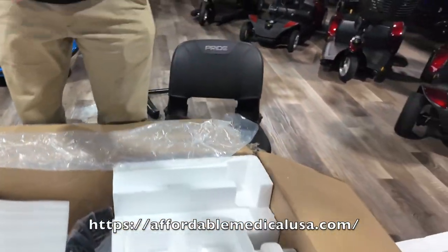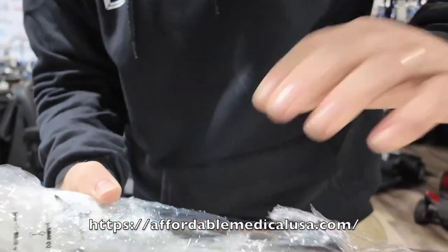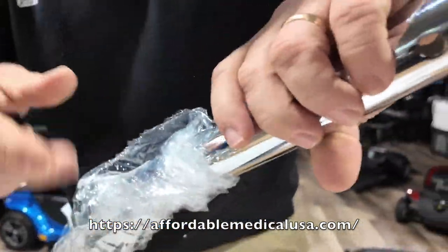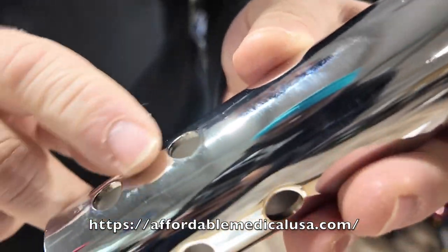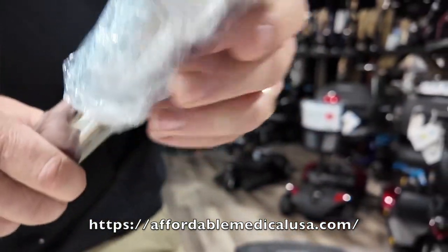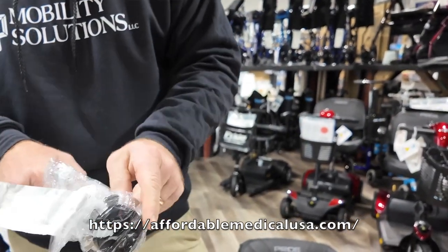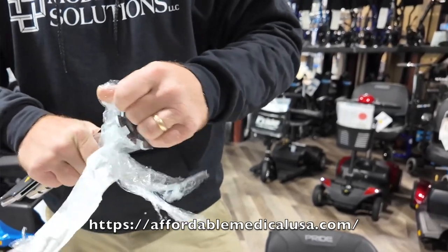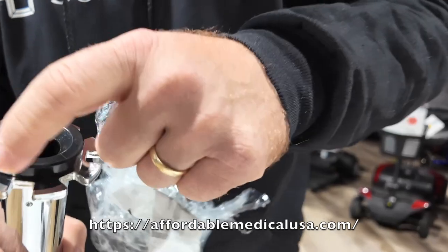Here's your seat post. I'm just going to unravel it and take the plastic off. There are different seat heights you can do with this — you'll see different notches on each side to adjust the seat height. The specs are on our page, telling you the different floor-to-seat and deck-to-seat heights. It's a swivel seat all the way around.